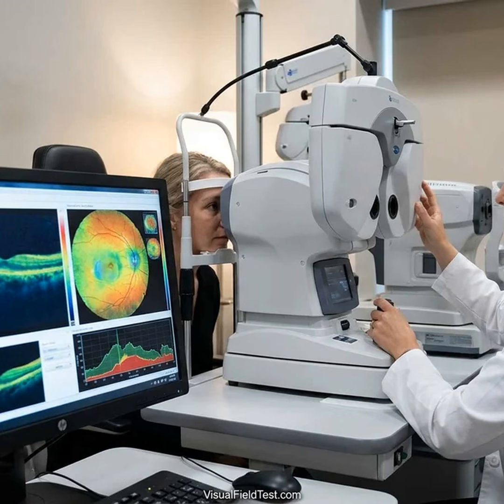In summary, in advanced glaucoma, the standard RNFL scan loses sensitivity due to the floor effect. But OCT can still play a role by checking the central macula and any nerve sections that aren't yet at floor. Also, it can help rule out other problems. For instance, if an OCT scan shows unexpected thinning that doesn't match the disease pattern, the doctor might suspect another eye condition, like macular edema, retinal scarring, etc., of which OCT is also useful.